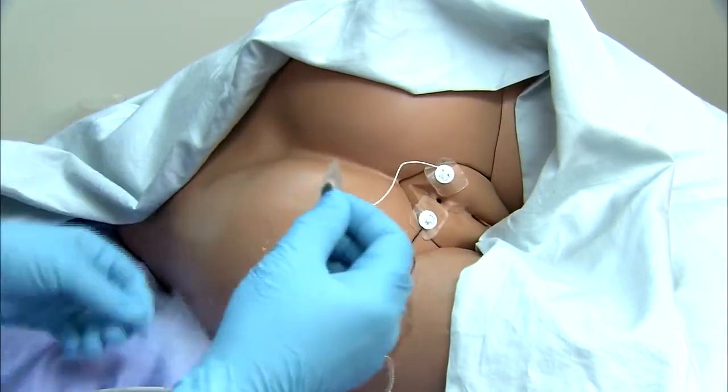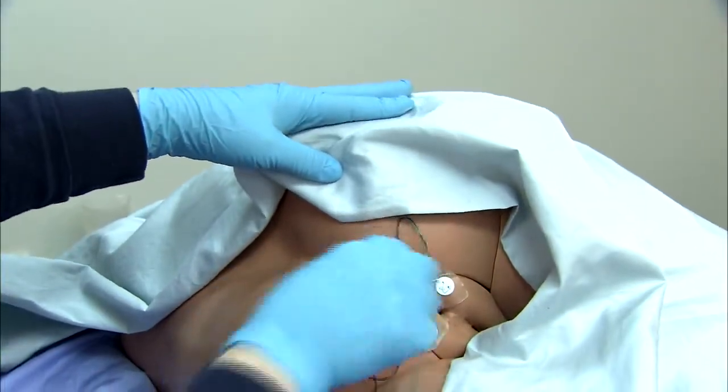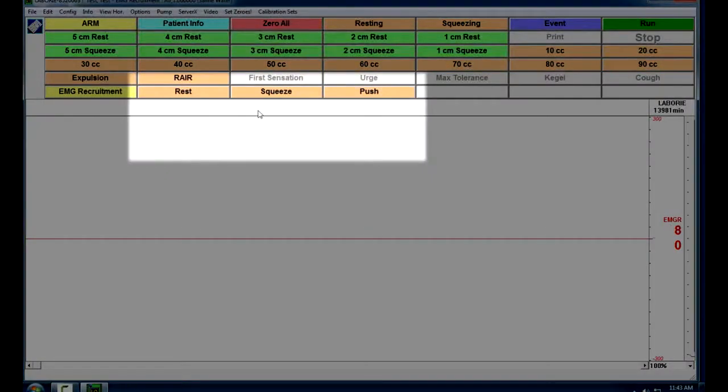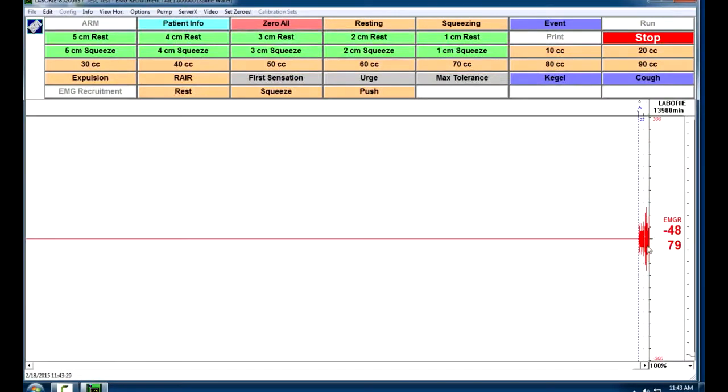The ground patch should be placed on a bony prominence. Once the patches are properly placed, we're going to ask the patient to rest for a few seconds. We'll ask them to squeeze while we're doing the test, plus we'll ask the patient to push or to bear down like they're trying to have a bowel movement. We'll click the run button up here in the upper right hand corner. You can see we're getting our tracings now.